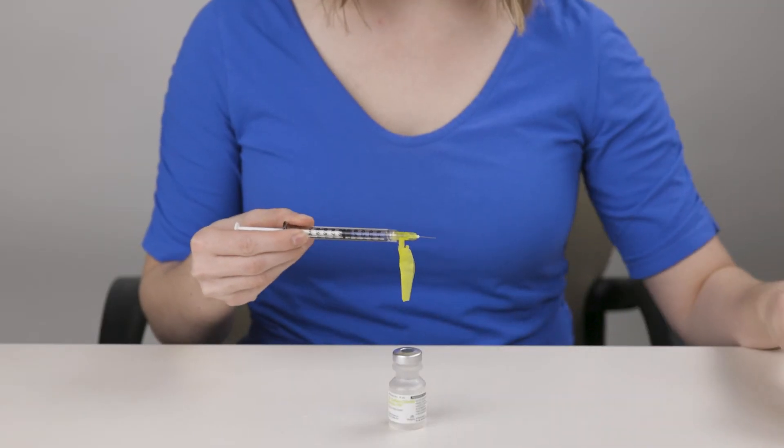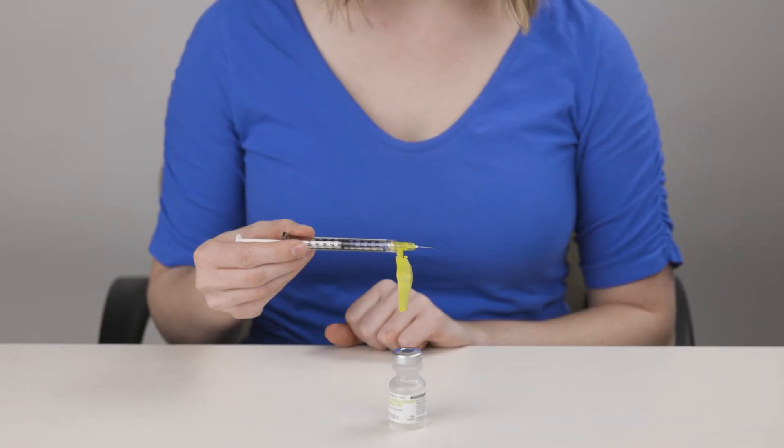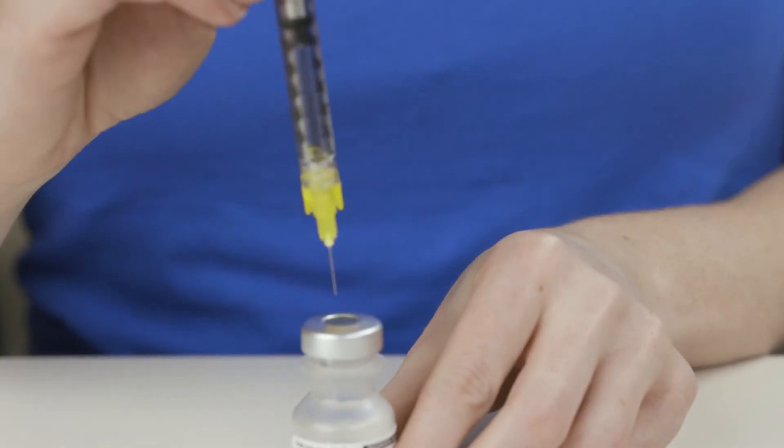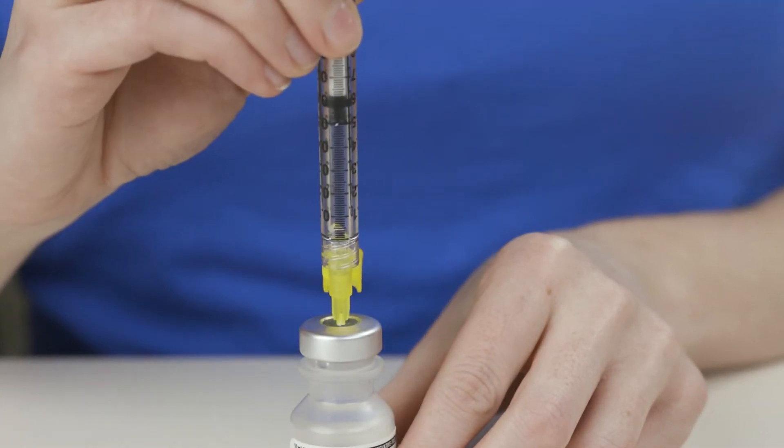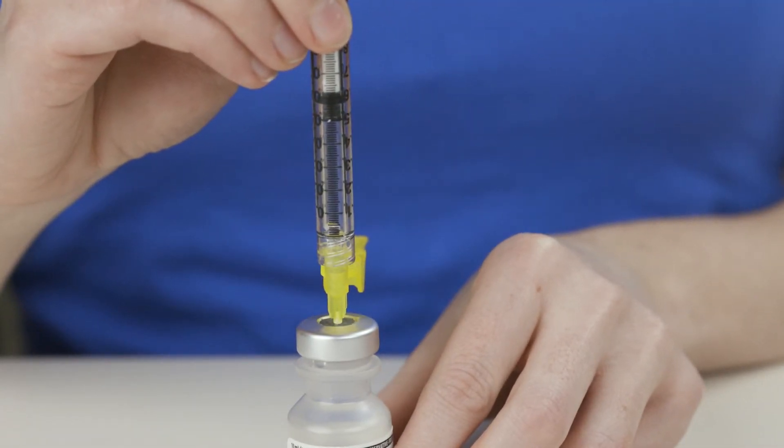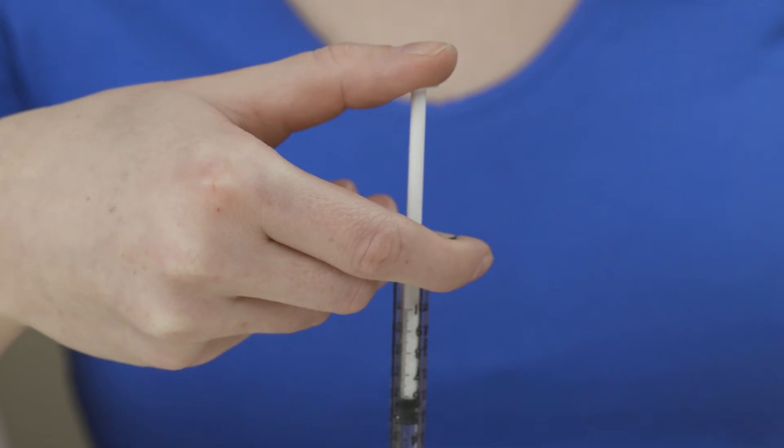Remove the needle cover from the syringe. With the vial upright, put the needle straight into the rubber stopper of the medication vial. Inject air into the vial.